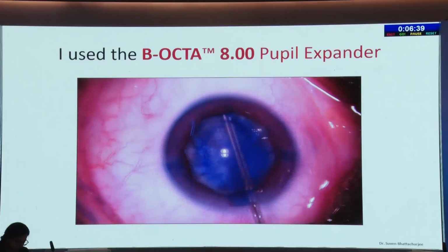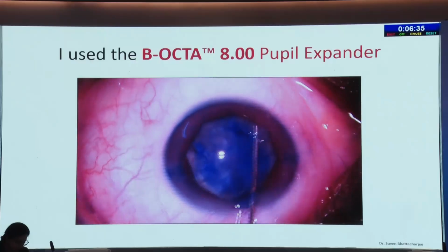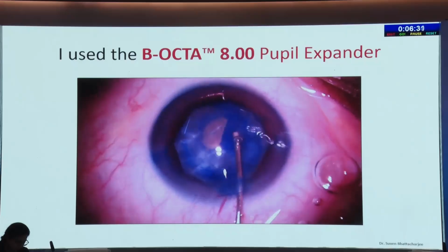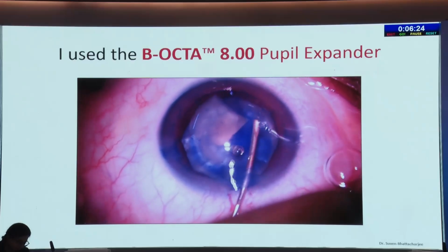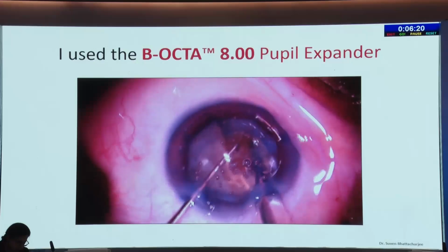Look at the fluid cortex. You can see the pools moving around. It's like lakes over there. I'm trying to break the loculation, and watch this. Yeah, that gush of fluid, if I had not done that massage, I would have probably had a locule and this capsular rhexis would have run.